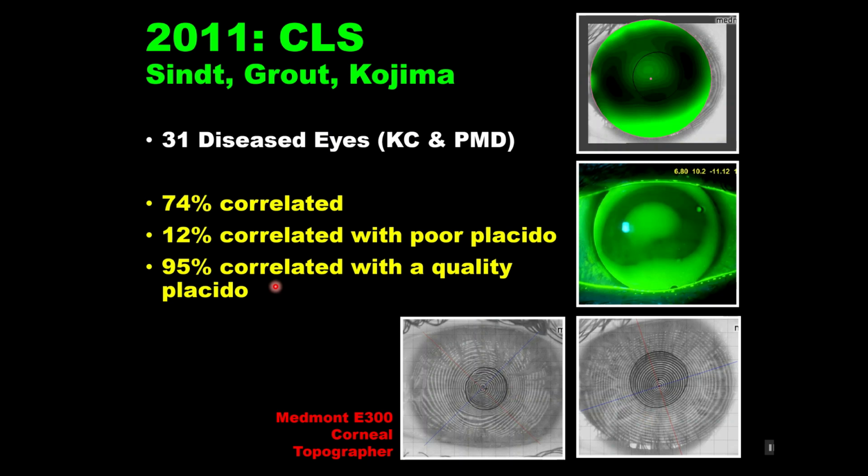So what this tells users is when you have a lot of distortion of the Placido, either a very dry eye patient or a lot of corneal scarring, the instrument may not predict the initial lens as accurately. Trial lenses may be the best way to begin. When you have good Placido reflection, then you can often just custom order from the contact lens software.